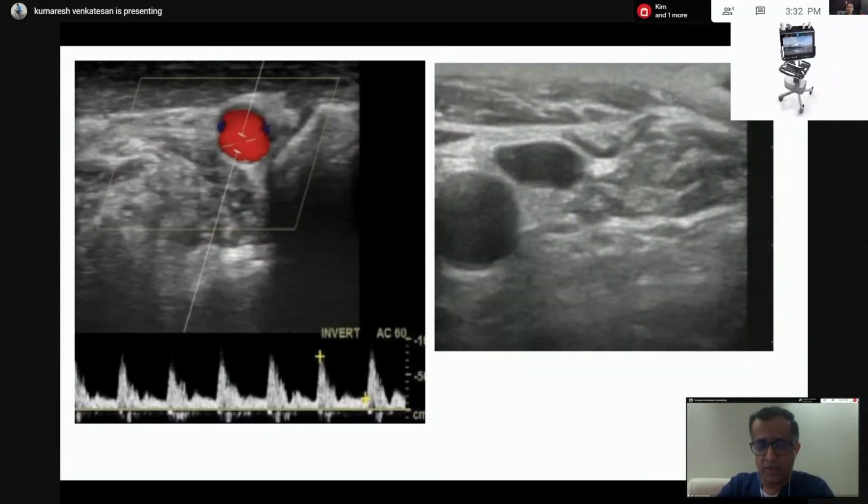Another patient doing a screening ultrasound. What you can see is there's only an artery. You can't see a vein. This was a patient with end-stage renal failure who had a previous tunnel line inserted. So the internal jugular vein was thrombosed and we could not visualize it. So we had to go for a different site.